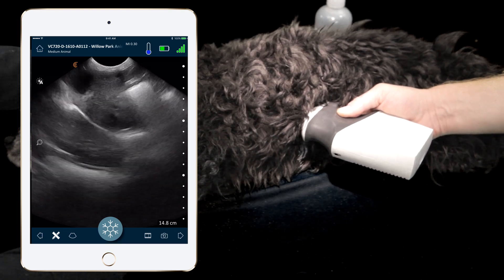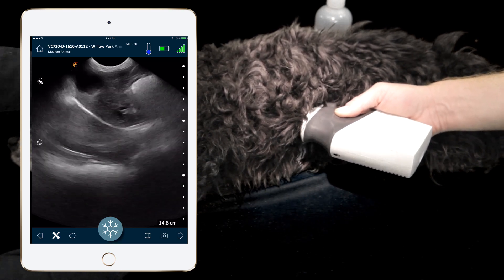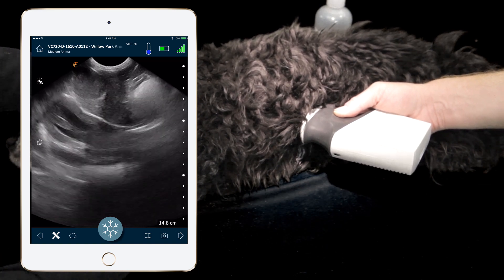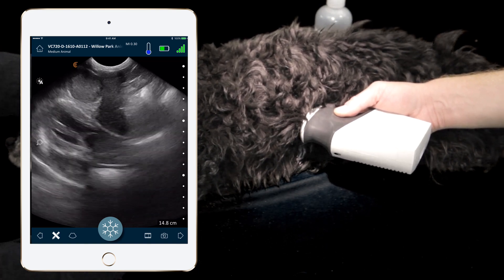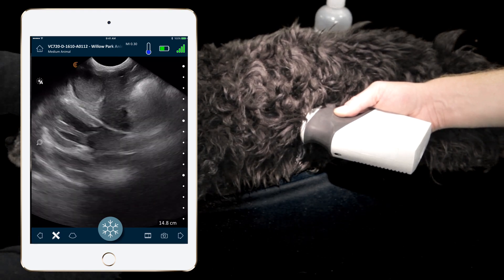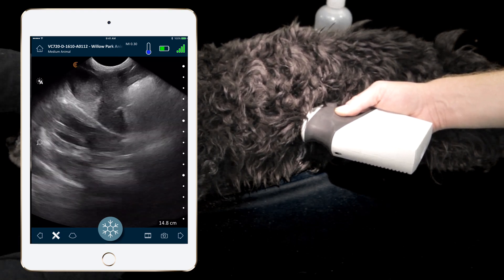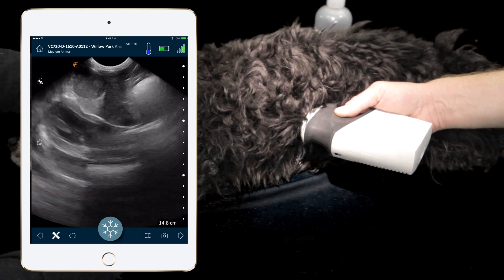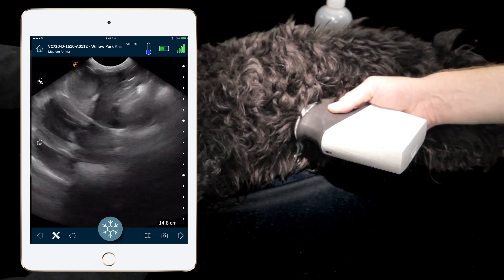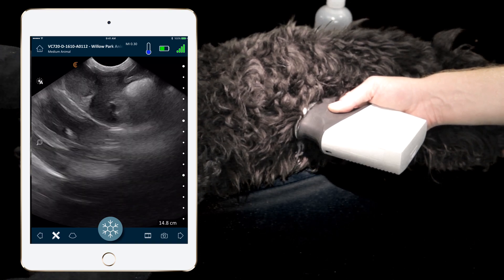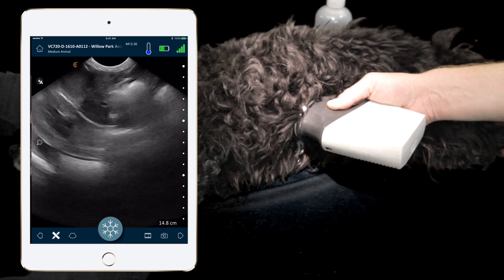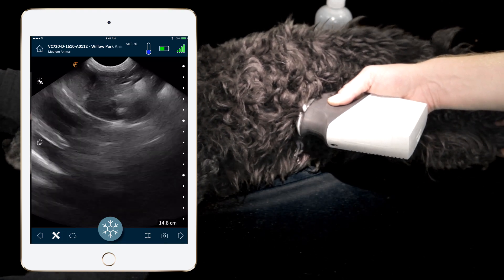We've reduced the abdominal component in the near field and now we pick up a nice view showing the left ventricle and the right ventricle. We can see the papillary muscles and the mitral valve in the near field of the left ventricle. This is a great spot to rule out pericardial effusion because we can see the apex of the heart and confirm there is no black rim of fluid around the apex of the left ventricle or separating the left ventricle from the diaphragm.